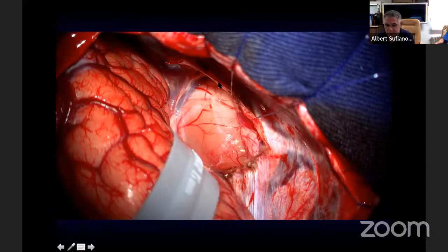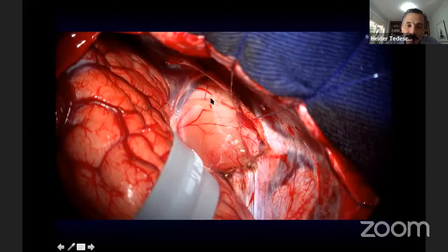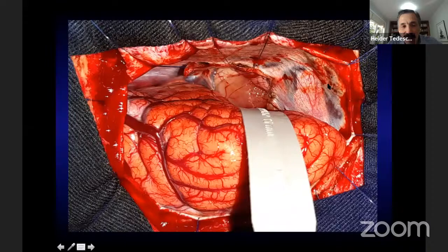Very interesting. Look here. After we open this gap, we see the brainstem is enlarged and the veins are on the back. So the precentral cerebellar vein would be around here. I cannot see it, but this is the window I need for this type of tumor. This is the situation with a picture taken from outside, not through the microscope, and the tumor is already here. So you just have to follow the tumor and you will be there.